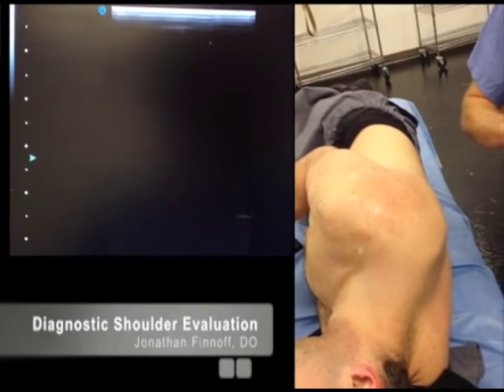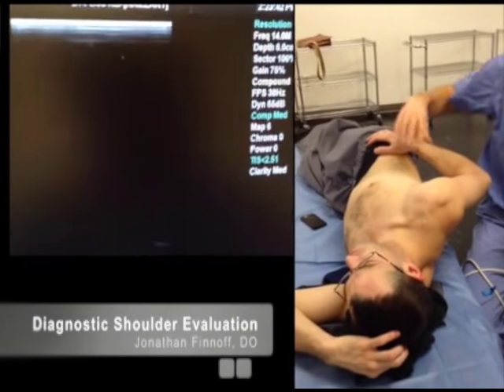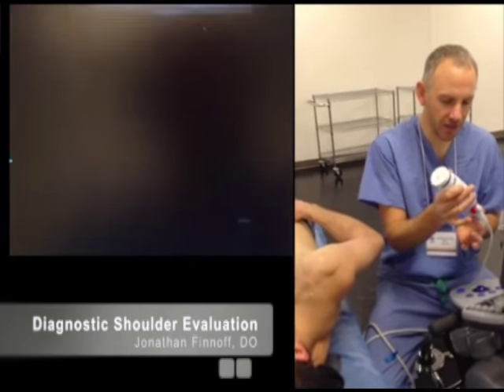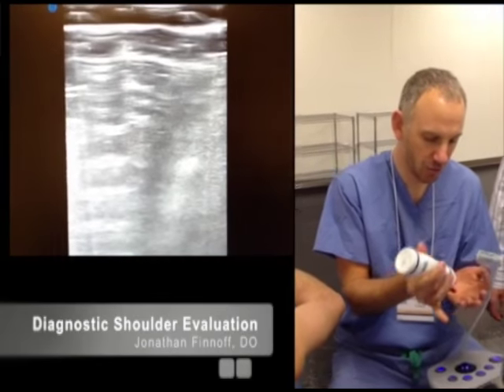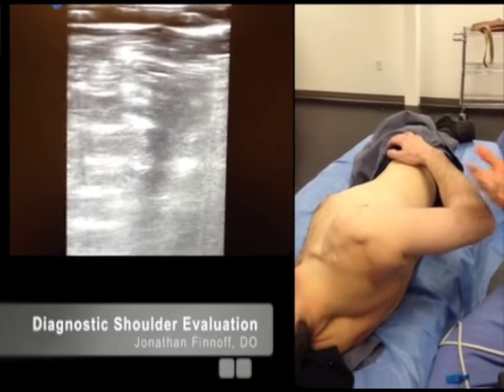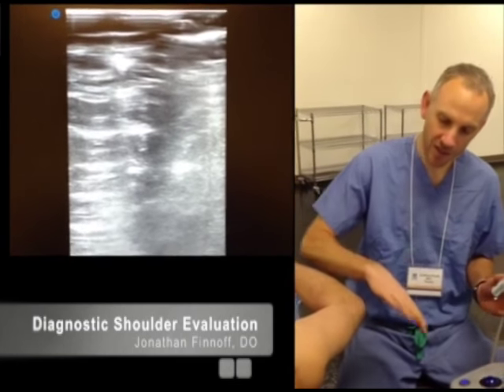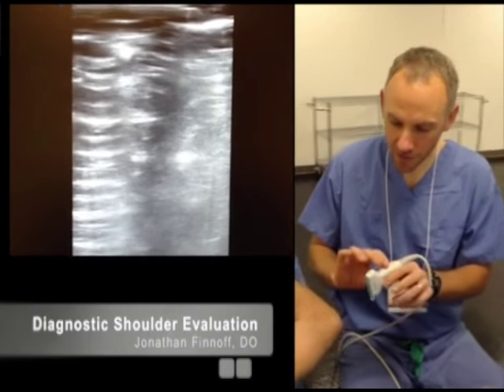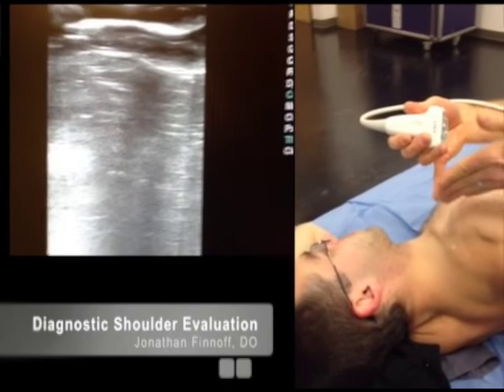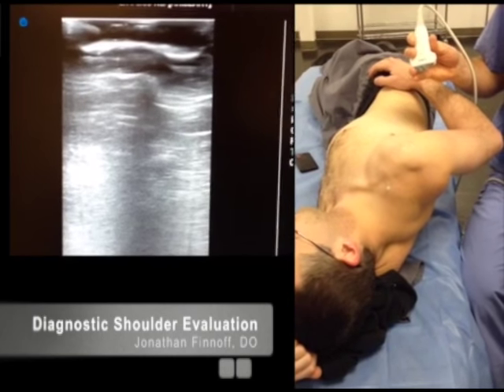After looking at all the posterior structures, I'm going to look at the supraspinatus. I'll have the patient put their hand on their hip — this is the modified CRASS position. It extends the shoulder, pulling the supraspinatus out from underneath the acromion and putting tension on it. When somebody's in a sidelying position in the modified CRASS position, gravity naturally keeps the elbow back, which is really nice compared to the seated position where the arm tends to drift forward. The supraspinatus comes out at a 45-degree angle between the coronal and sagittal planes. I'll look at it initially in short axis.